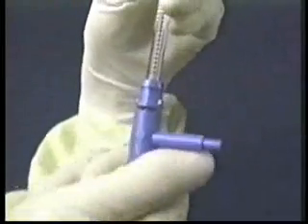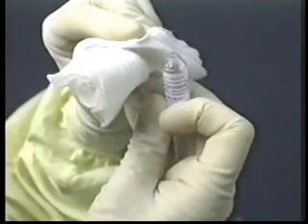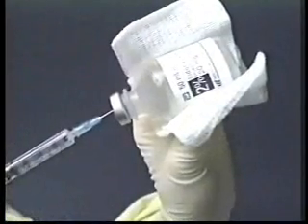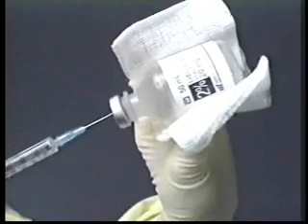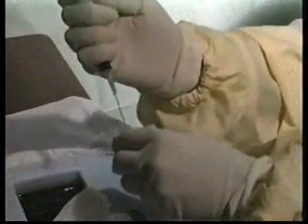Now assemble your manometer. Make sure the adapter is in place. Break the top off the lidocaine with some gauze and draw it up. If you will be using 2%, have someone assist you with drawing it up. If no one is able to assist, use the sterile gauze to release the needle. Dispose of the contaminated gauze and attach the 25-gauge skin infiltration needle.